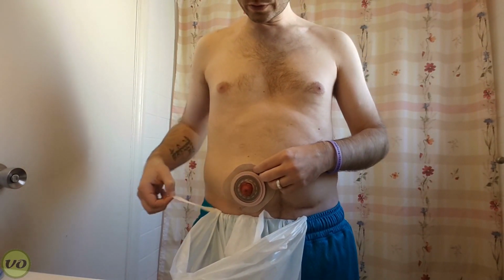Right, so I put it right over the stoma there. I'm going to make sure that everything is nice and tight before I take off these other release liners. And you'll notice here some of the ring is actually coming up through the gap where the wafer is. That's perfectly fine. That's actually something that I want to see because it'll fill in any gaps so that there's no leaks. So then I'll start to take off these release liners.